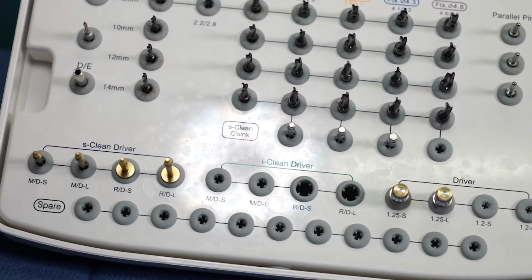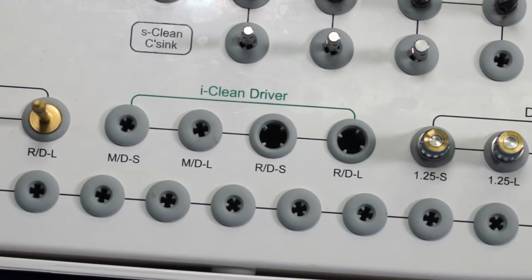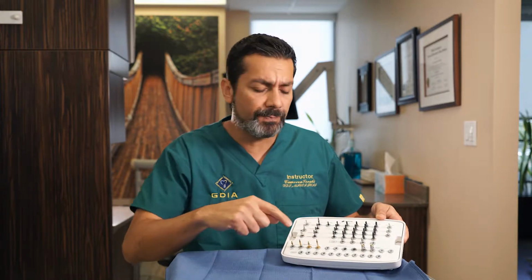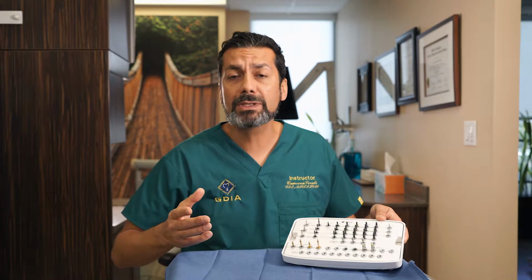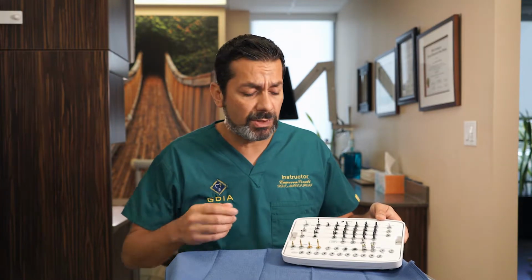On the bottom here, these are your implant drivers. So if you take a look, over here it says S-Clean drivers, and on here it says I-Clean drivers. In the Dentis system, two of the subsystems that they have are the S-Clean and the I-Clean. The I-Clean is tissue level, and the S-Clean is bone level. We generally use the bone level implant. It's what's mostly used.